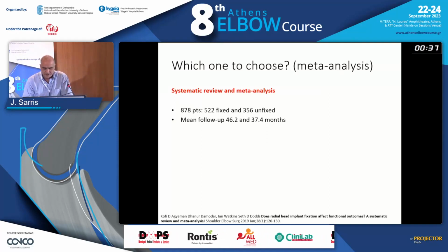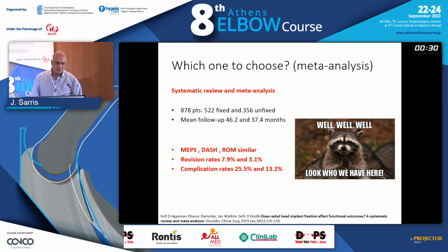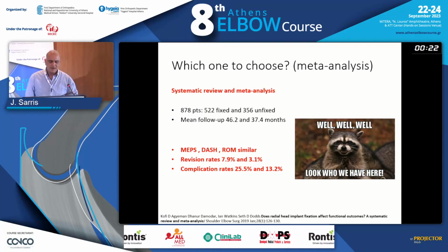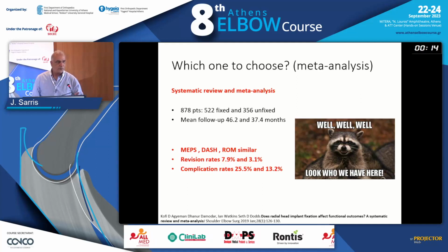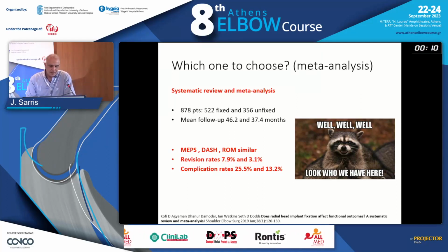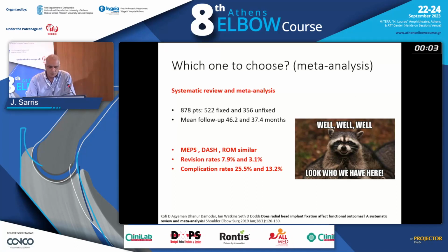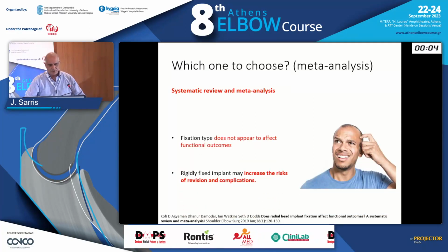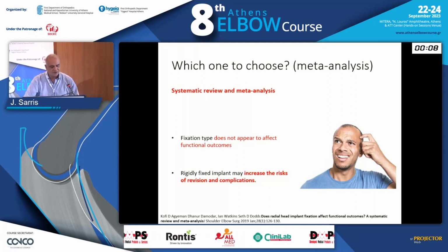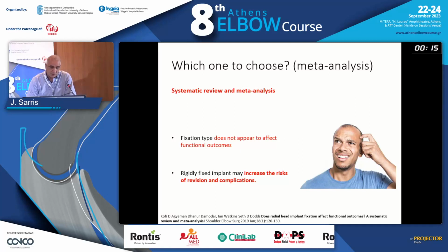So here is another meta-analysis and systematic review with a lot of patients, almost 900. You see there is quite a difference between the ones that used a fixed prosthesis and the ones that used an unfixed one. And also there is a gap in the follow-up of about 9 months, and we just have to keep that in mind. In this paper, the scores were similar for both fixed prosthesis and spacer. And the revision rates were more than double in the fixed prosthesis. Complication rates were almost double in the fixed prosthesis. What is stated in the paper, though, is that fixation type does not appear to affect functional outcomes, and the rigidly fixed implant may, on the other hand, increase the risk of revision and complication.